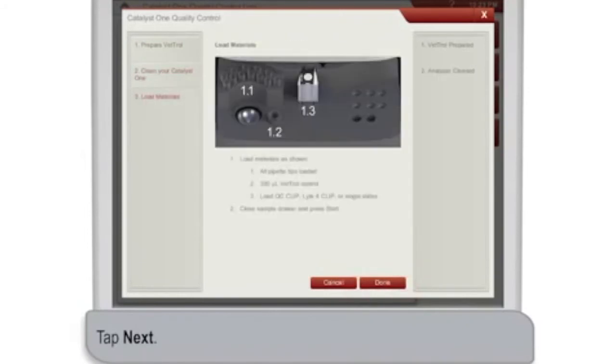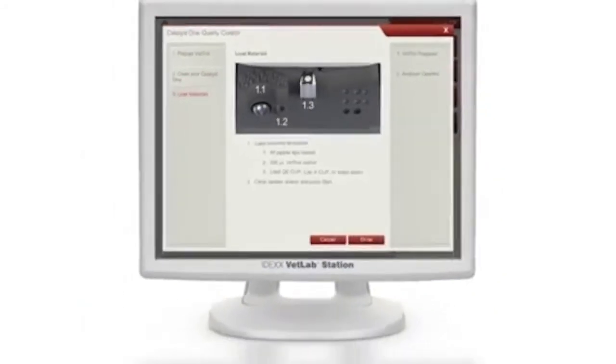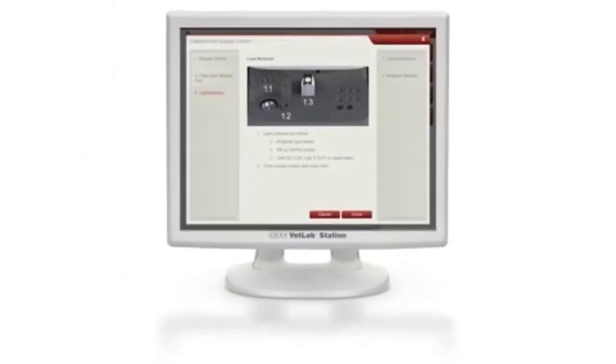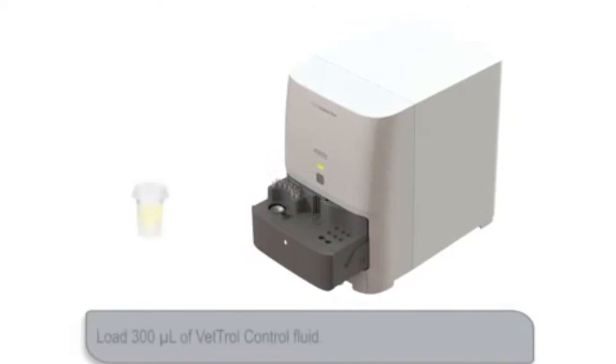Next, it's time to load the materials in the sample drawer on the analyzer. Fill the pipette tip section of the drawer. Load a sample cup containing 300 microliters of properly prepared control fluid in the sample cup holder.